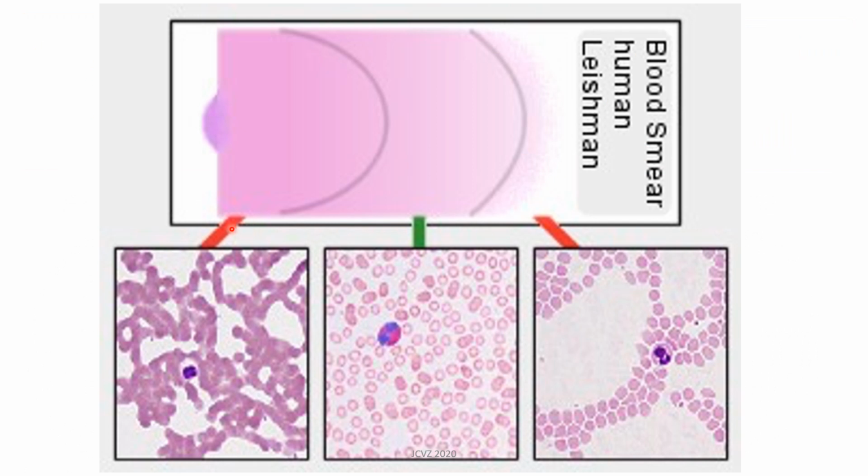This is a realistic photo of your peripheral blood film and its parts when viewed under the microscope. So we have our head here, or this is our application point. Under the microscope, this is how the cells would look like. Your RBCs are overlapping with each other. And then you have here your WBC, but it's not very clear what type of WBC this is. So this is what the cells would look like under the microscope if you're going to view the head.